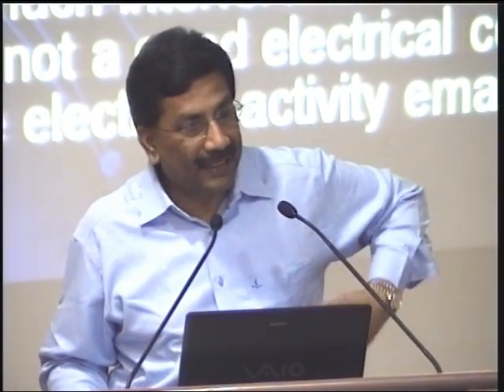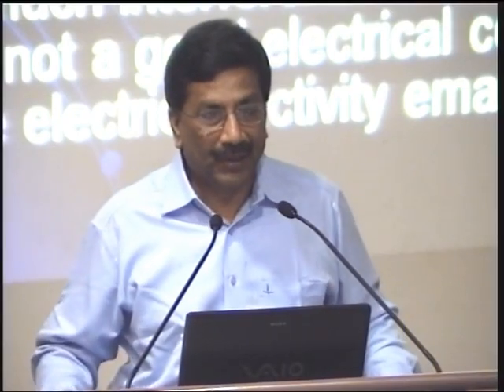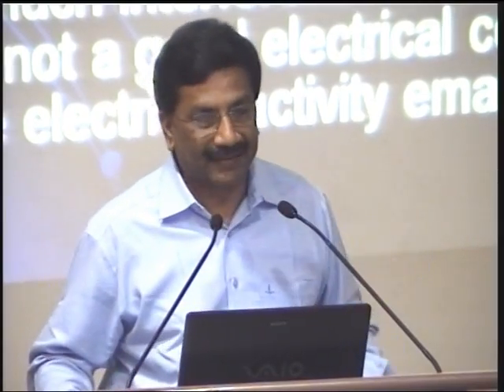How do we see the lateral surface? I look at it from my hands. So although your heart is in the center, you tie down the electrodes on the limbs because electricity travels all over our body. That is a remarkable property of the heart. No other organ does that.